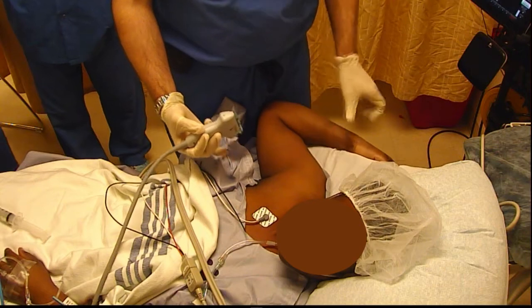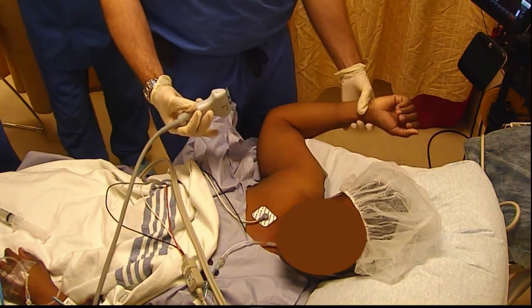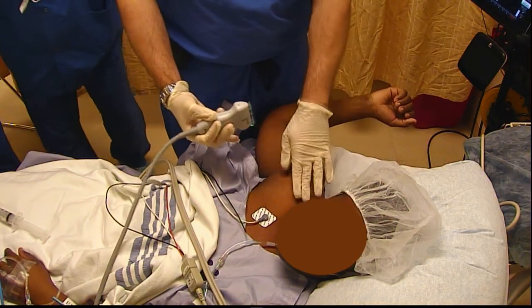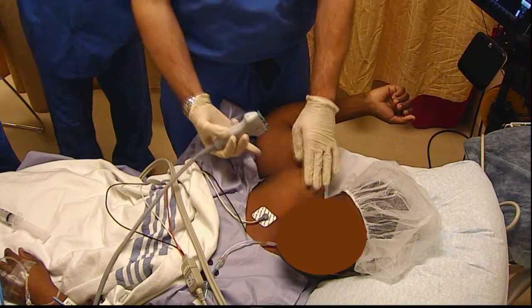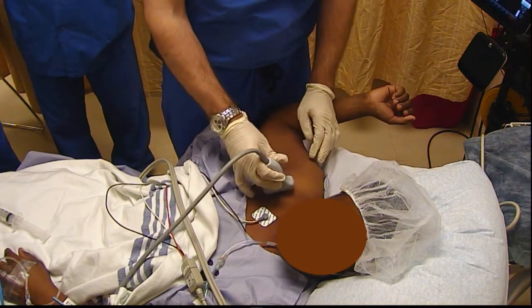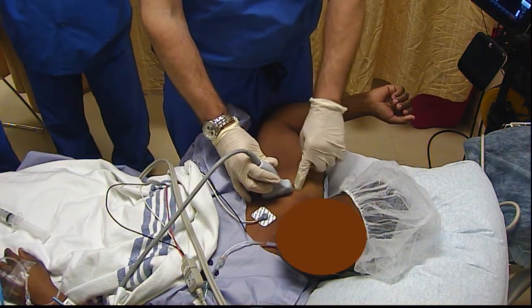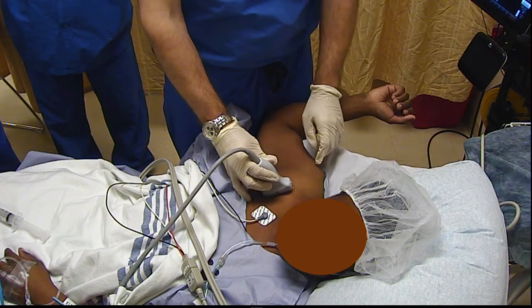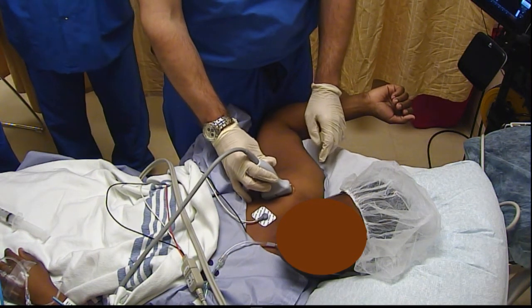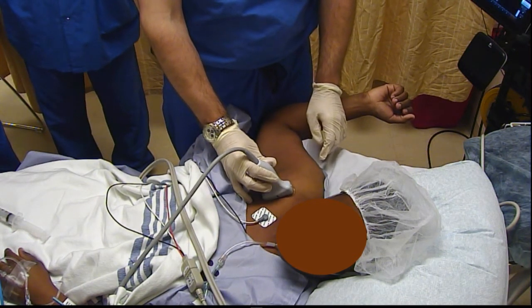Notice the arm position is abducted, externally rotated — it's going to help displace the clavicle out of the way. You're going to feel some cold gel on your shoulder. We start around the deltopectoral groove and just scan medially and laterally under the clavicle, caudal to the clavicle.